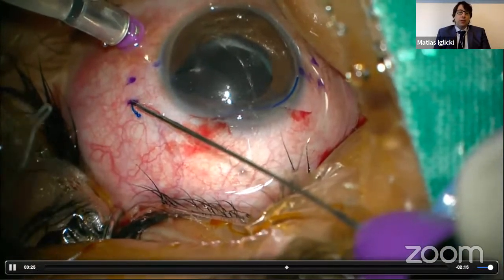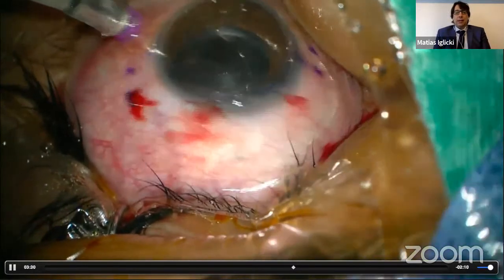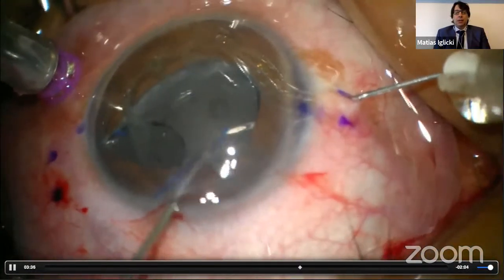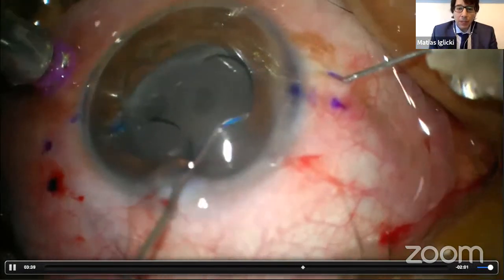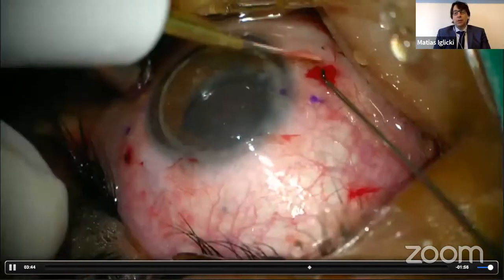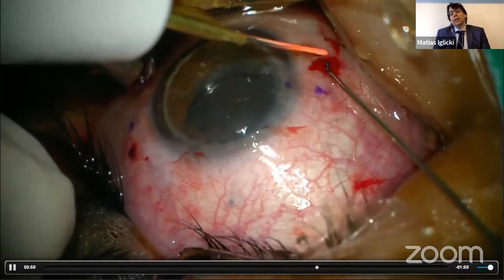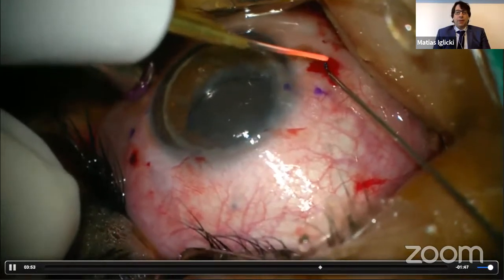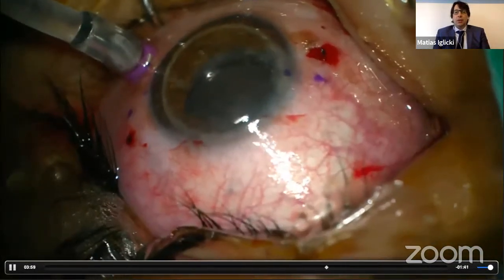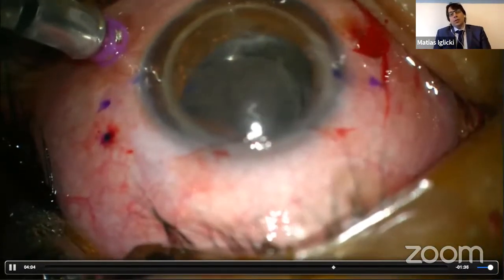And the first question I saw on the Zoom was: how big is the button? We will discuss that at the end of the talk. The same thing we do with the second haptic. Let me show how easily the haptic goes inside the lumen of the ultra thin wall needle from TSK. I think nowadays we strongly believe that this needle is the best for ophthalmology. And thank you so much to TSK for thinking about ophthalmology as well. TSK is very well known for aesthetics and medicine in general, but now they are focusing on ophthalmology, luckily.